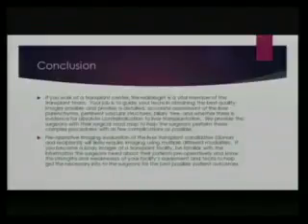And this is just my wordy conclusion. If you work at a transplant center, the radiologists have a very integral role in the transplant team. But your goal is to make sure that you're getting the best images possible, so you have to talk with your techs and tweak things, sometimes based on your patients. If you have somebody with a ton of ascites, you may need to go drain them before they get their MRI. This can obviously be a life-altering surgery. It's not to be taken lightly, and you need to do as good of a job as you can to evaluate these patients preoperatively to give your surgeons a good roadmap.